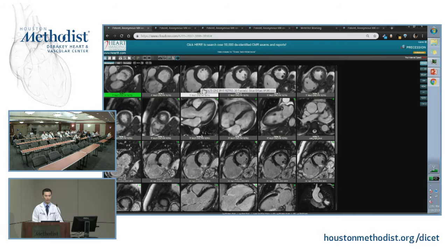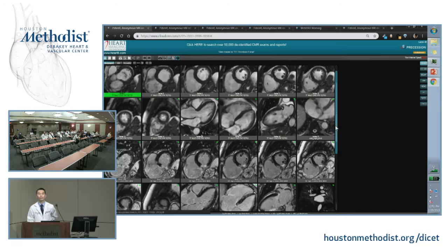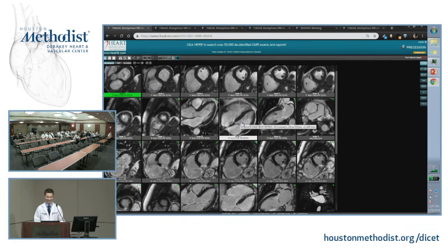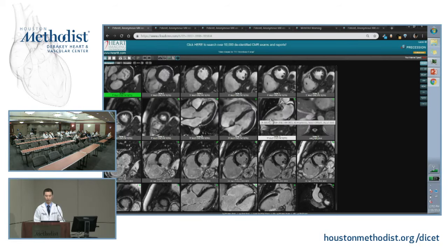So a diaphragmatic segment of the RV, LV, or both? Okay. Just a diaphragmatic segment. The whole RV down below there. Yeah, the basal, right? The inferior part of the lateral wall also. It's really only like the very top anterior portion of the RV. There is a central TR jet. Yes, Dr. Nagueh picked up on the turbulence, yes, on the four chamber. That is true. So there is central TR, secondary TR, but as Dr. Shah has been pointing out, there's actually quite a bit of hypokinesis, even possibly akinesis along the lateral RV free wall. Okay.